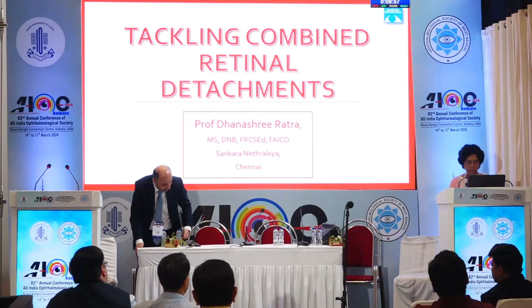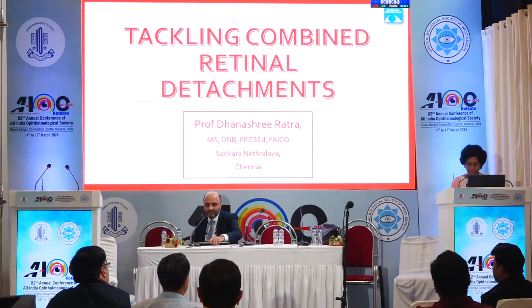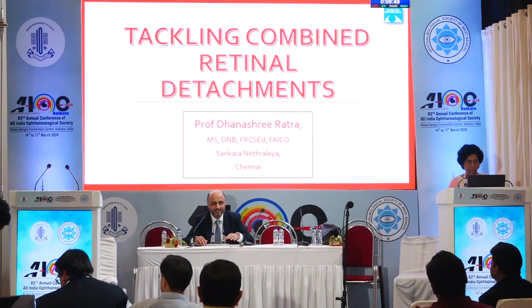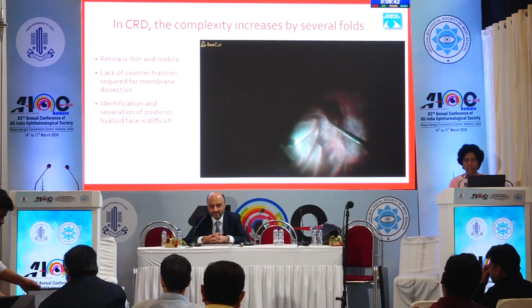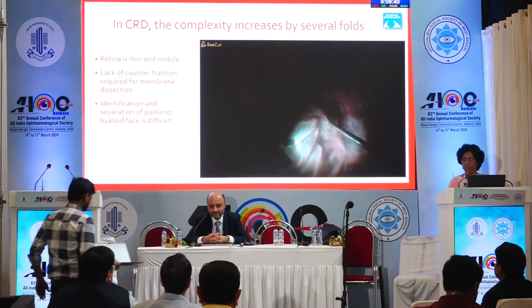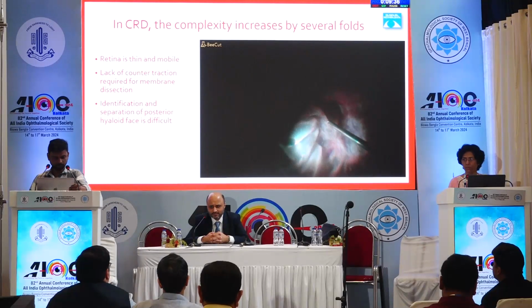So I'll be talking to you about tackling combined retinal detachment, and after all these excellent surgeries that you have seen, I think there's very little remaining, but let me cover whatever is there. The combined retinal detachment by far I think is the most challenging case that a VR surgeon will encounter in his lifetime. The complexity of the surgery is increased by several folds.